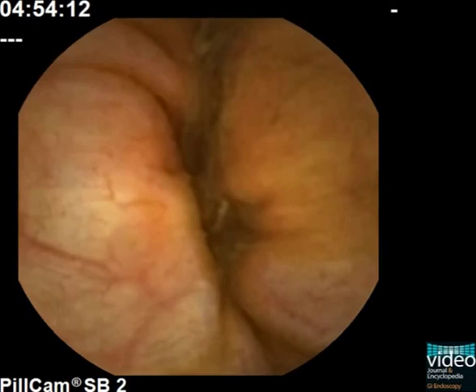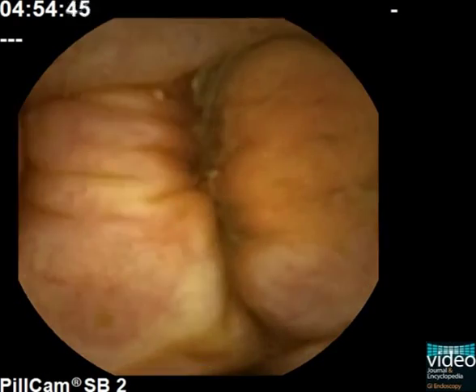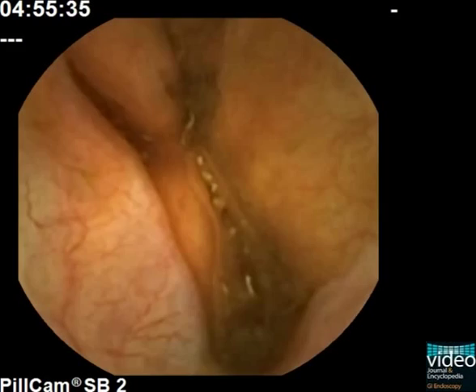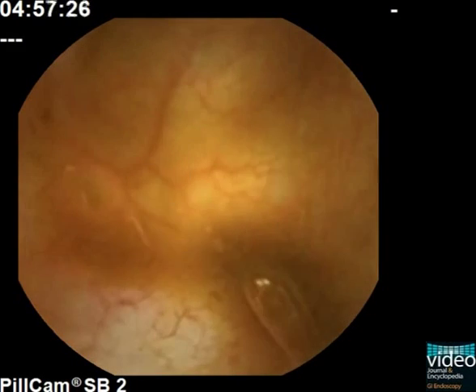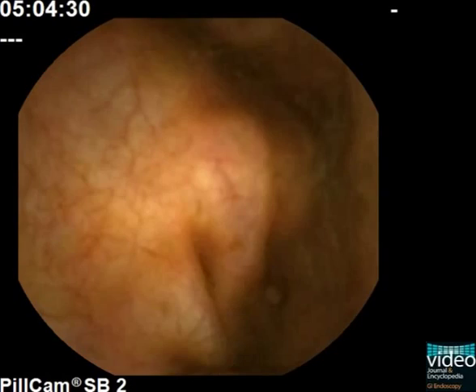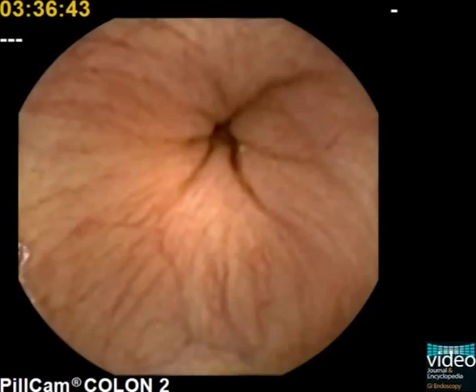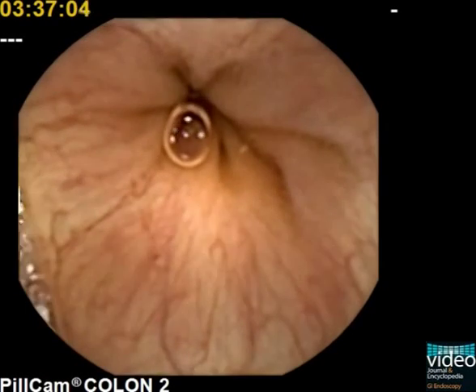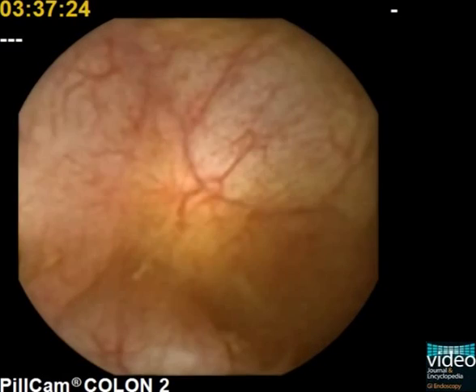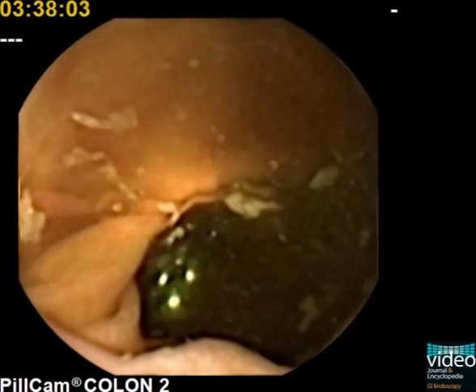Hyperplasia of lymphoid follicles is present in many patients in the terminal ileum without any pathological significance. Change of mucosal appearance and lack of villi denote the passage into the cecum through the valve of Bauhin. An appendiceal orifice and the valve of Bauhin are more reliably visualized with the use of a bi-directional colon capsule endoscope.